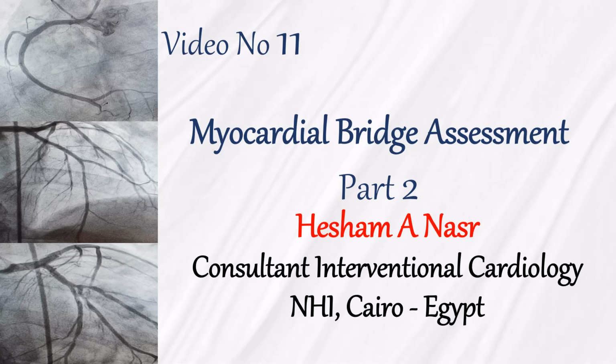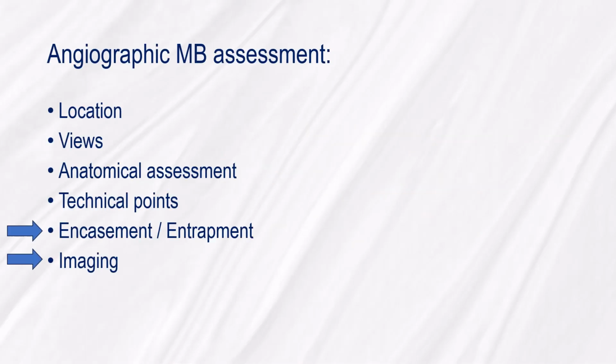Welcome back. This is video number 11, Myocardial Bridge Assessment, Part 2. We will discuss these items.